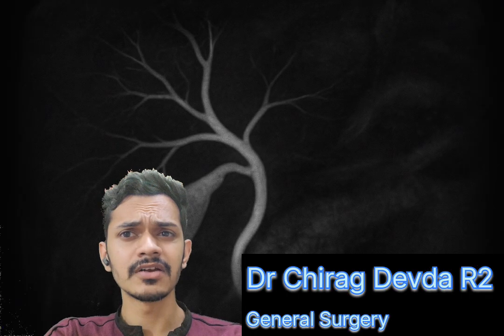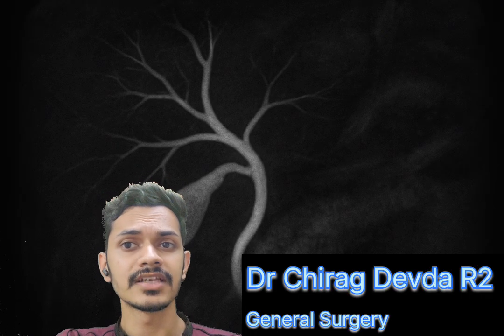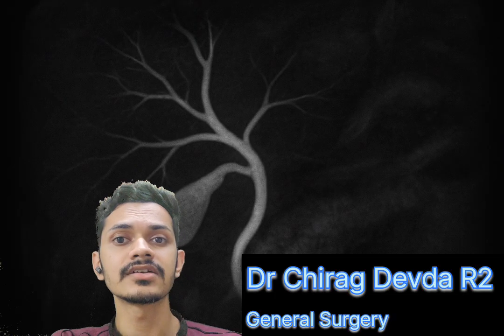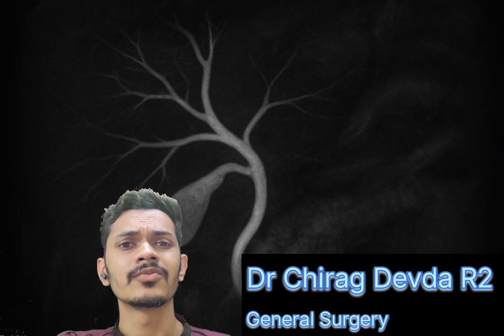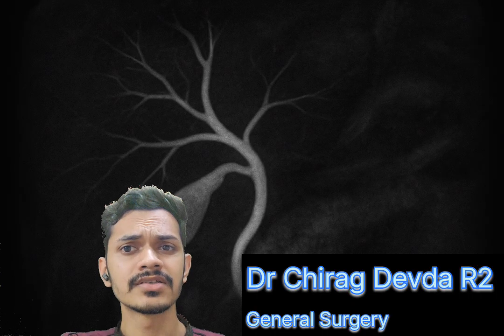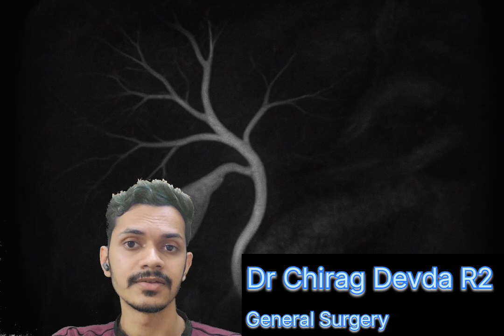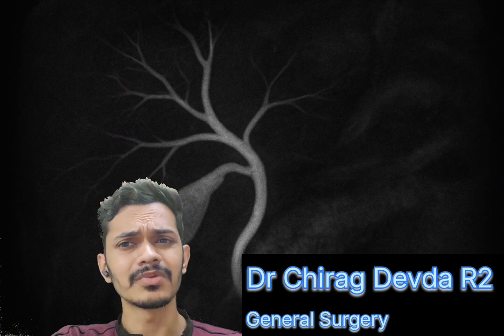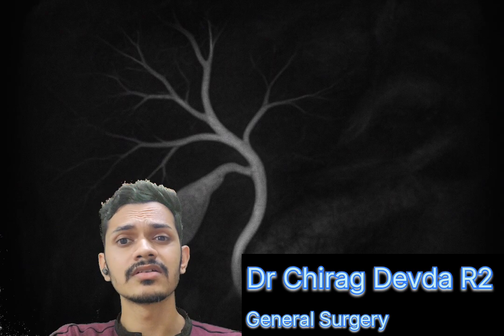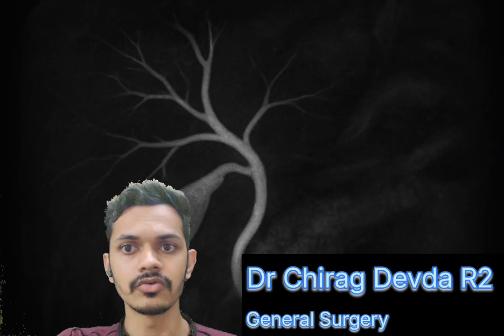There are special variants of MRCP also, which include secretin-enhanced MRCP, in which secretin is given IV, which stimulates pancreatic juice. Therefore, we can get better visualization of the pancreatic duct and side branches. There's 3D MRCP also, with thin slices plus post-processing, and we can get surgical planning due to that.